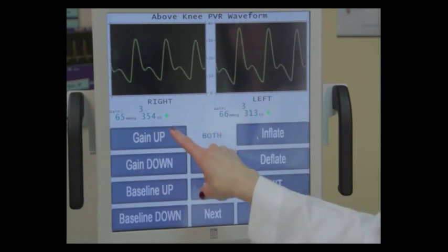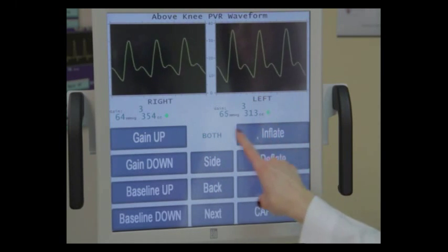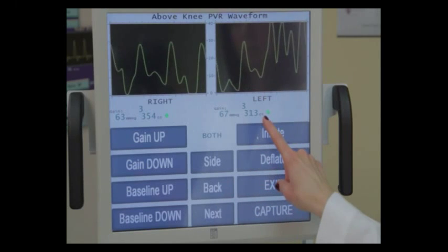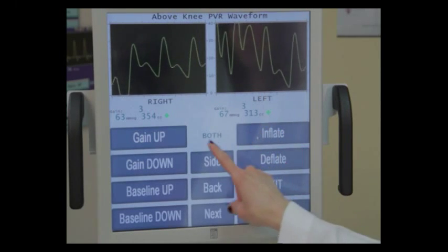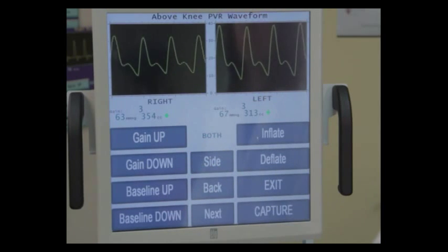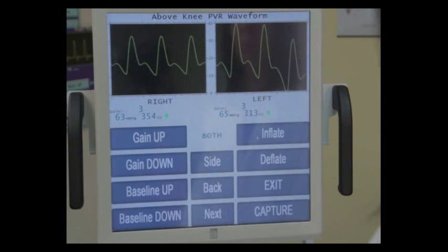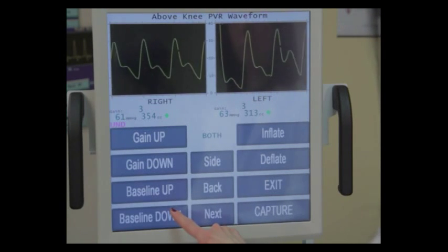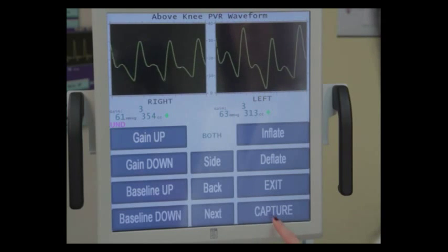The green diamonds are predicated on the right to left volume. So we have a volume of 313 on the left and a volume of air of 354 on the right. If those two values are within 15%, the indicator lights will both read green. You can also use the baseline down to move the waveforms down without changing the scale.